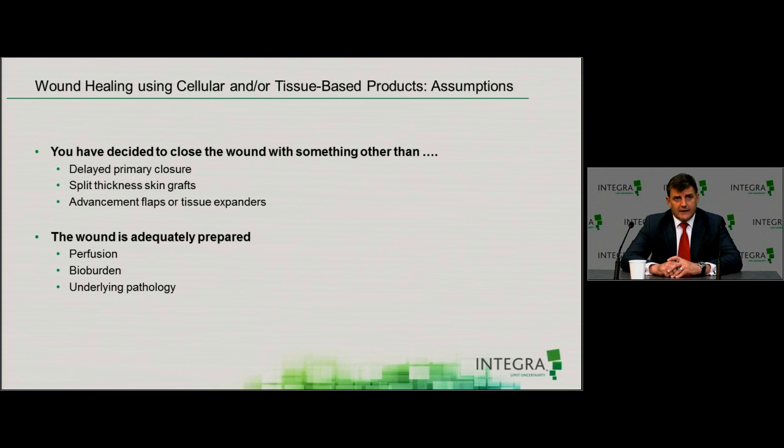So we'll go over that in a moment in detail, but when we are thinking about when to use IDRT therapy, we're really thinking about patients who may be a candidate for grafting or an advancement flap. They may not do well with advancement flaps. There might be a patient that we would use tissue expanders on and then advance those flaps. But at other times, an example would certainly be over a below-knee amputation that has dehisced. We debride that and use IDRT therapy with great results instead of using things such as tissue expanders or Z flaps, which are other ways of going about this.